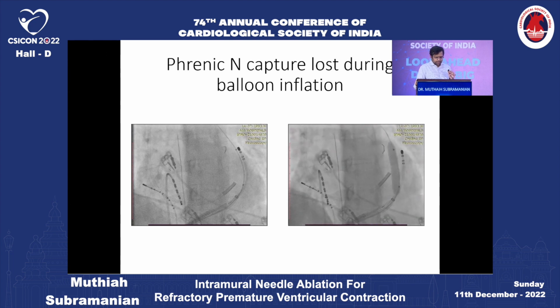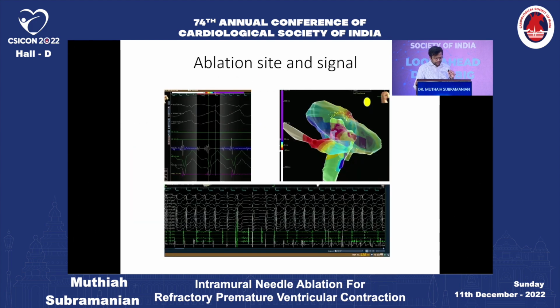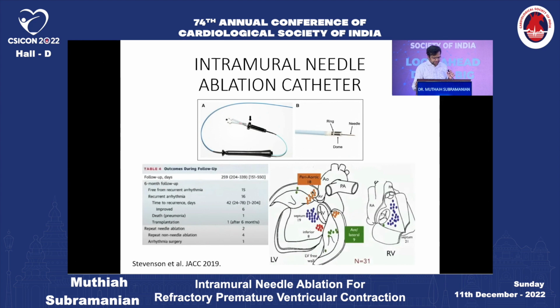But the wire mapping, if done correctly, can be very helpful in really localizing where the substrate is coming from. So this was the ablation site and the signal.